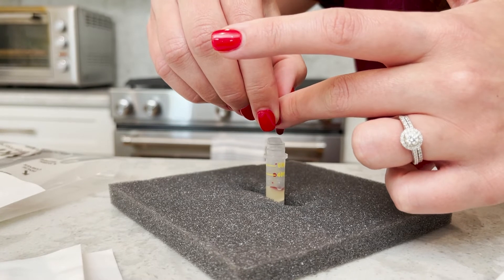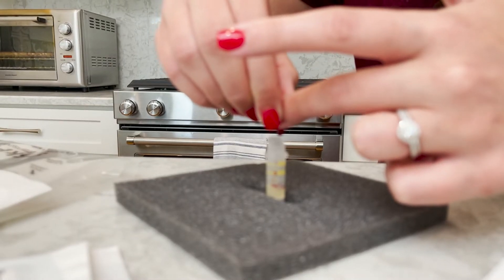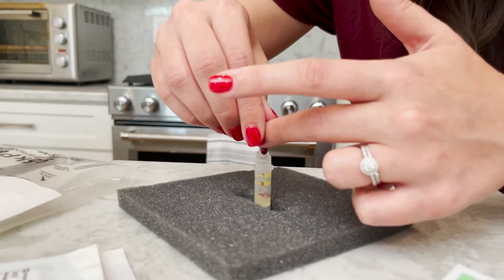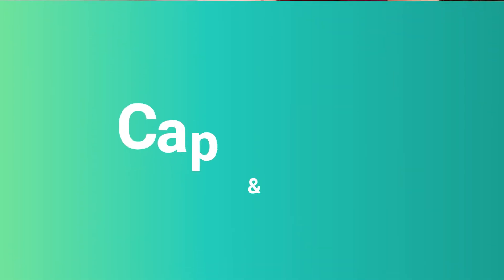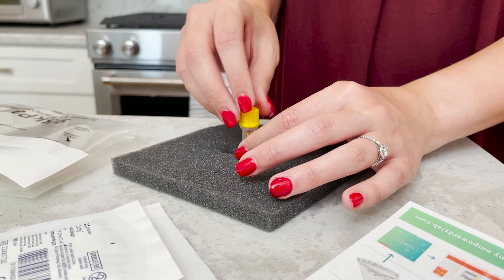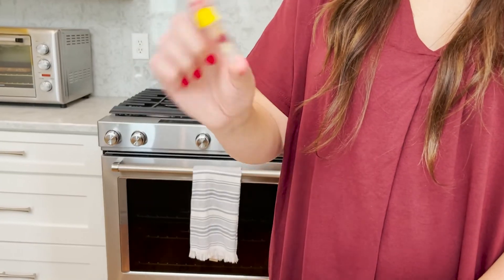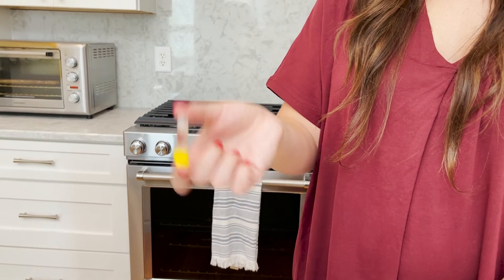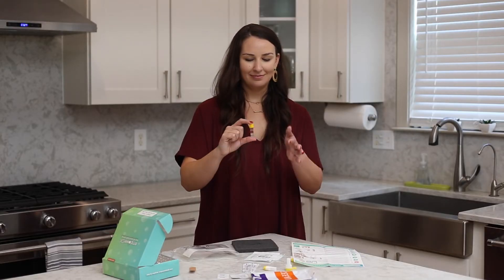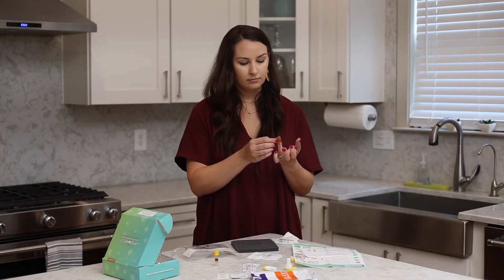If your blood stops flowing, warm your hand and prick your finger again by repeating steps 3, 4, and 5. It may need to be a different finger. Step 6: Cap and mix. Firmly snap the cap on the microtainer tube until it's secure. Gently invert the microtainer tube back and forth several times to mix the blood. Gently tap the side to release any air pockets. Apply bandages as needed.